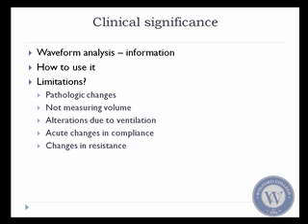Limitations to anything about waveforms is that you have to understand the pathological changes that occur to the waveforms, and that you're also not measuring volume. That's really important to mention over and over again, that anytime you're looking at these pressure waveforms, you have to infer the compliance and resistance that are taking place, and you can actually be fooled very easily if you don't take that into consideration. So remember, you're not measuring volume.